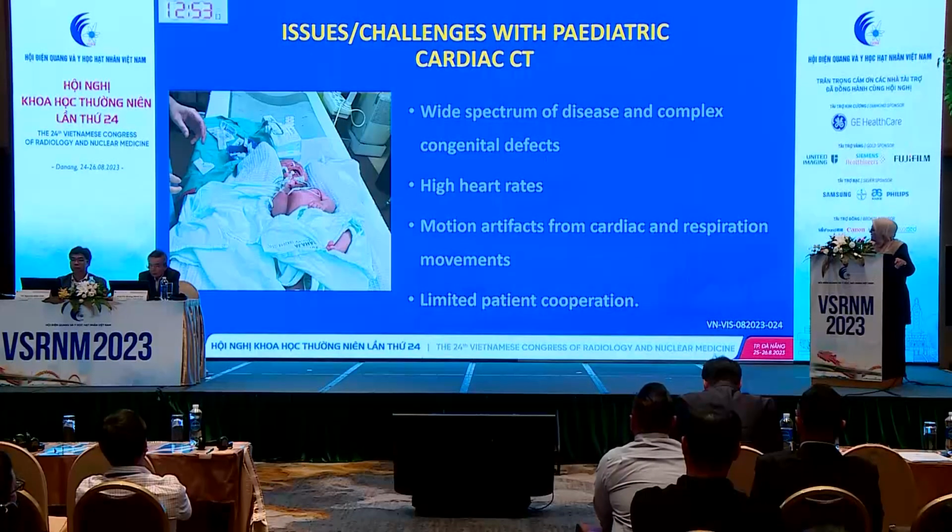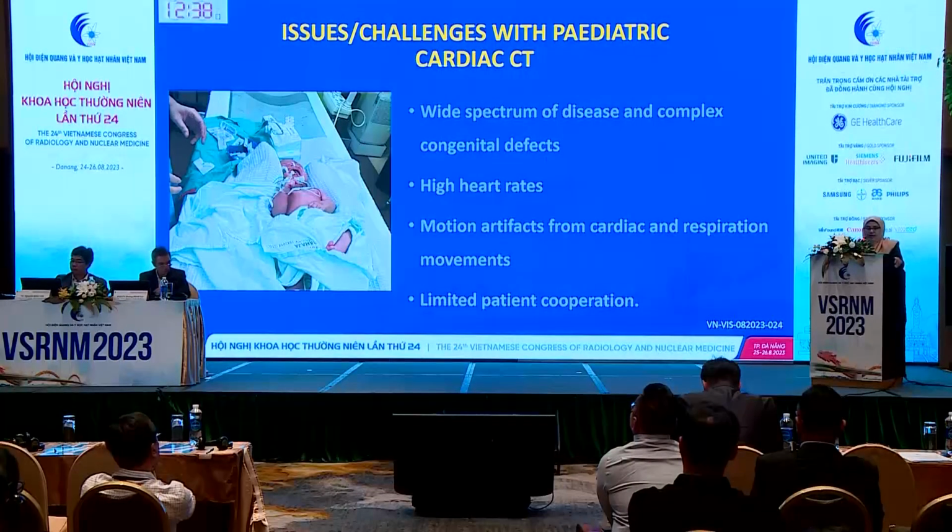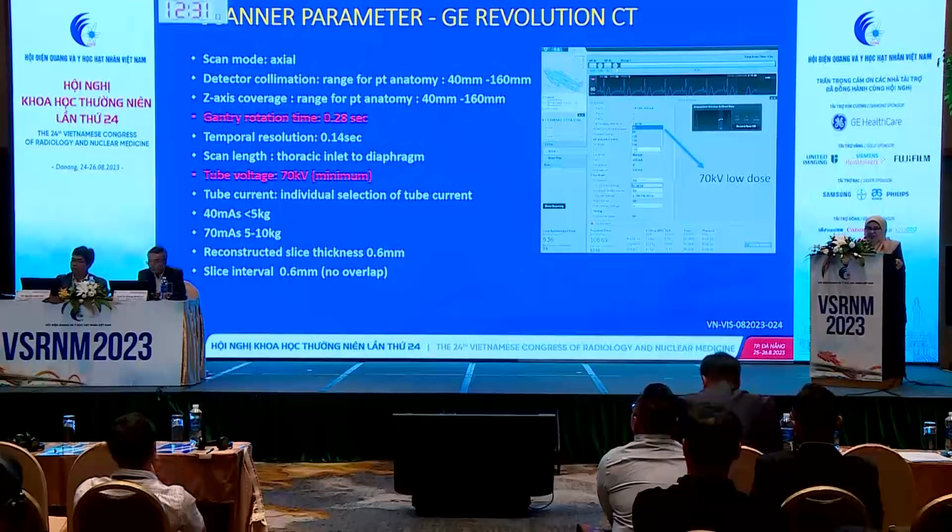You have a wide spectrum of disease, and the diseases are complicated, congenital defects, and definitely issues related to high heart rate, because pediatric heart rate is not the same as adult. And you will anticipate motion artifacts related to cardiac and also respiratory motion. And definitely limited patient cooperation.